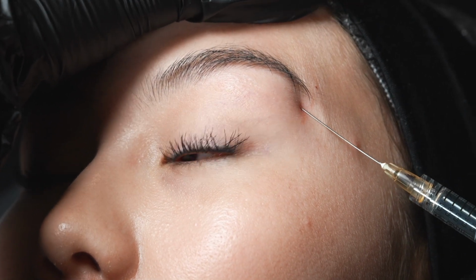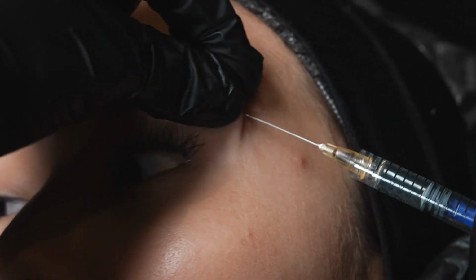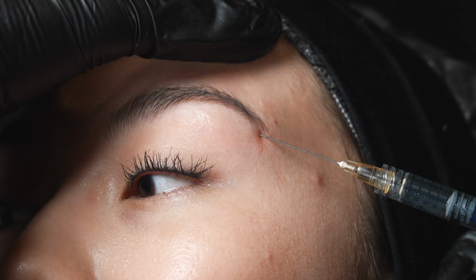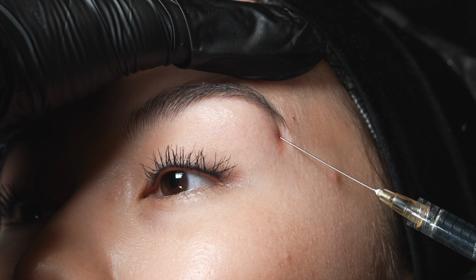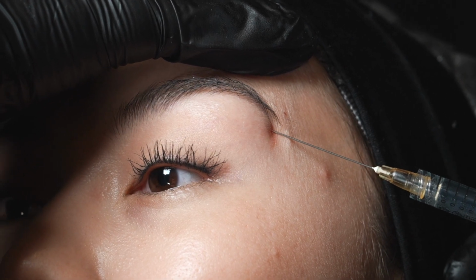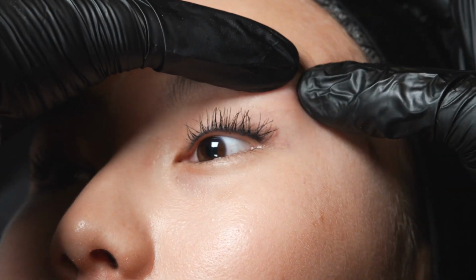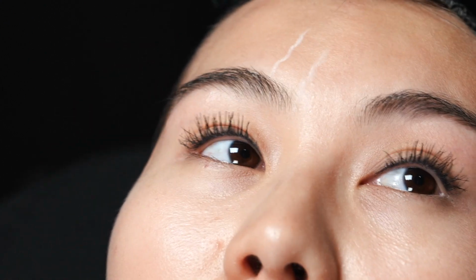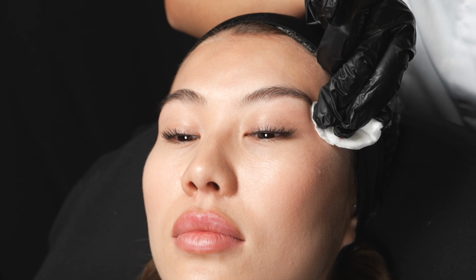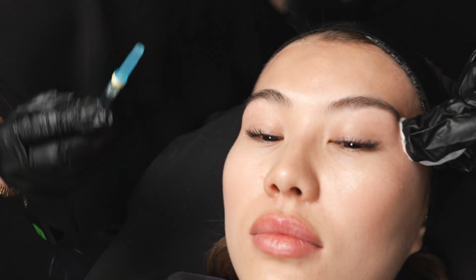И в моей практике я сначала начинаю с ботулотоксина, но понятное дело, что у нас есть и другие опции с точки зрения медицинской эстетики, но я комбинирую терапию для того, чтобы достичь такого эффекта приподнимания брови. Потом я расправляю, делаю небольшой легкий массаж. И все, мы закончили. Я сейчас покажу вам игольчатую технику работы в лобной области. Если, допустим, недостаточно, то мы можем всегда доколоть.